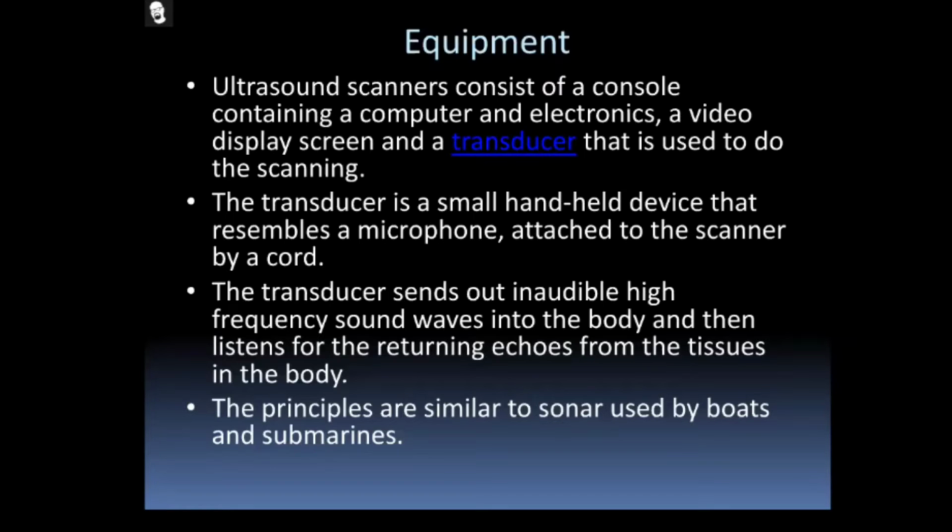That is very important. Suppose, for example, you place the ultrasound probe on the stomach. Through that scanning, you can see the gallbladder, the liver, the stomach, some part of the kidney, and other parts like the intestine. Okay, so the doctor asks you to please scan the liver, saying I want to see the clarity of the liver. At that time, you need to know where the liver is and how the liver looks during real-time monitoring. That is the very important thing you need to note.